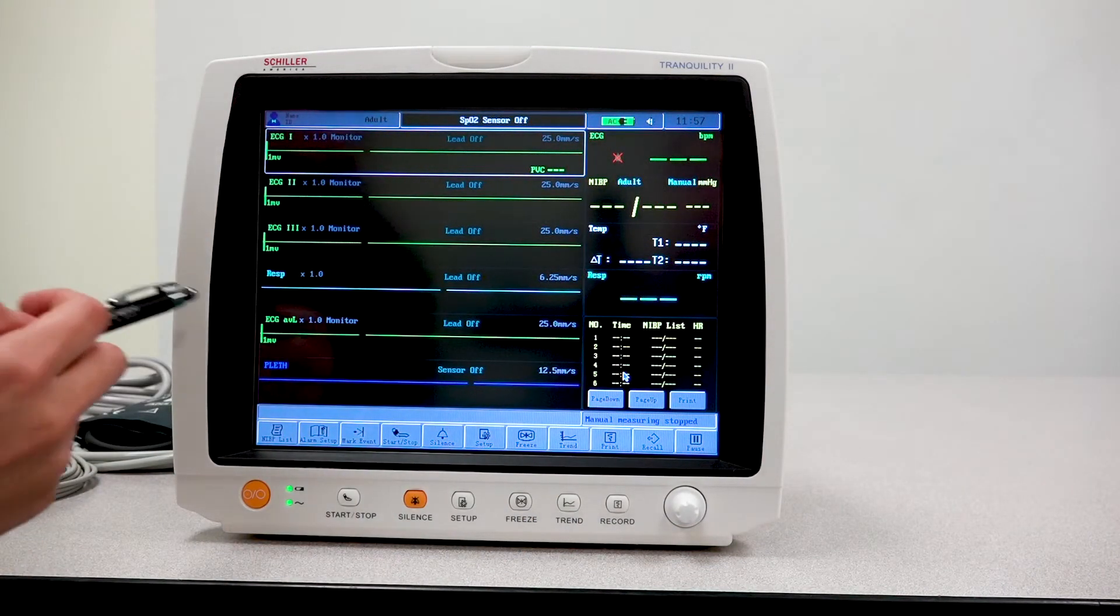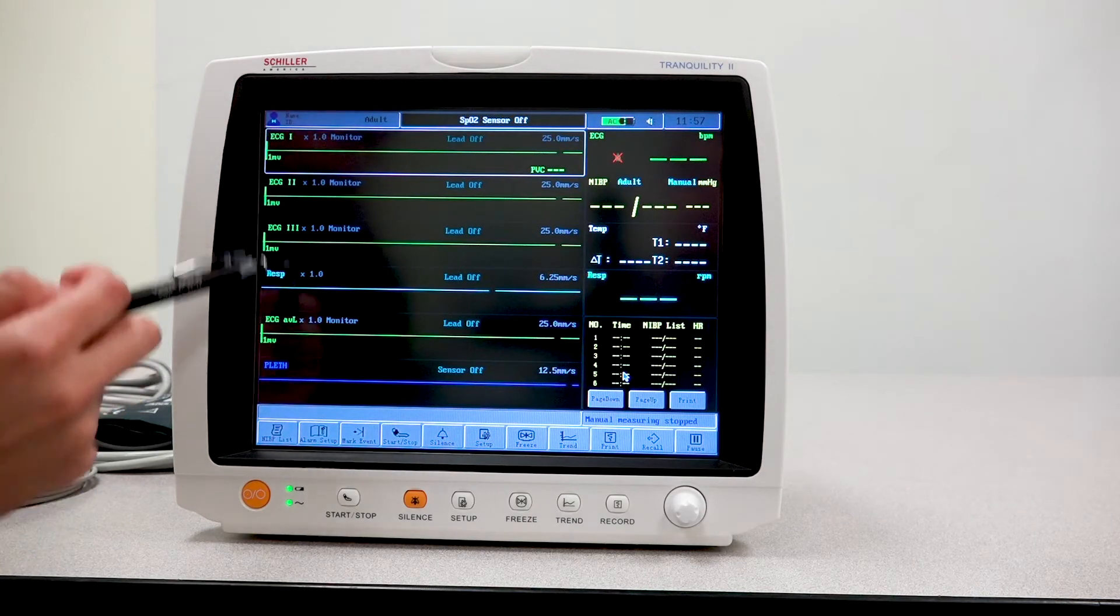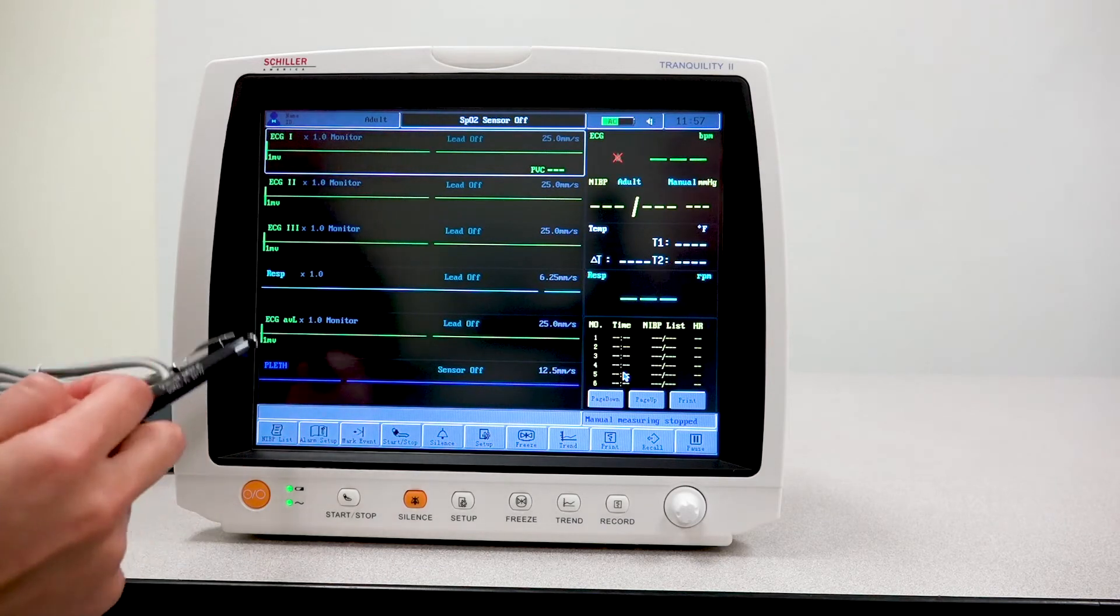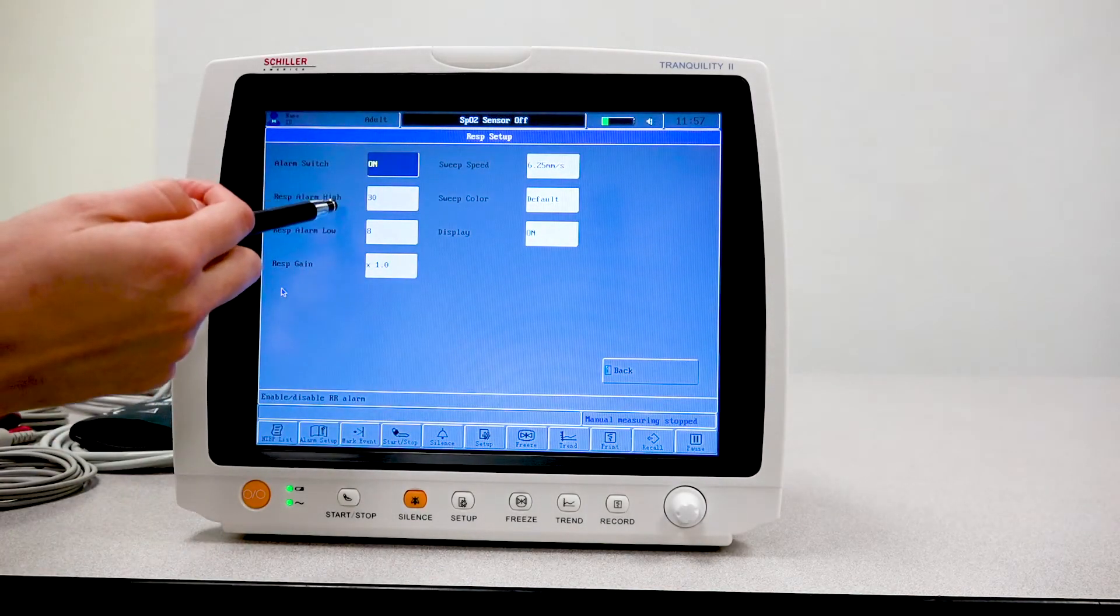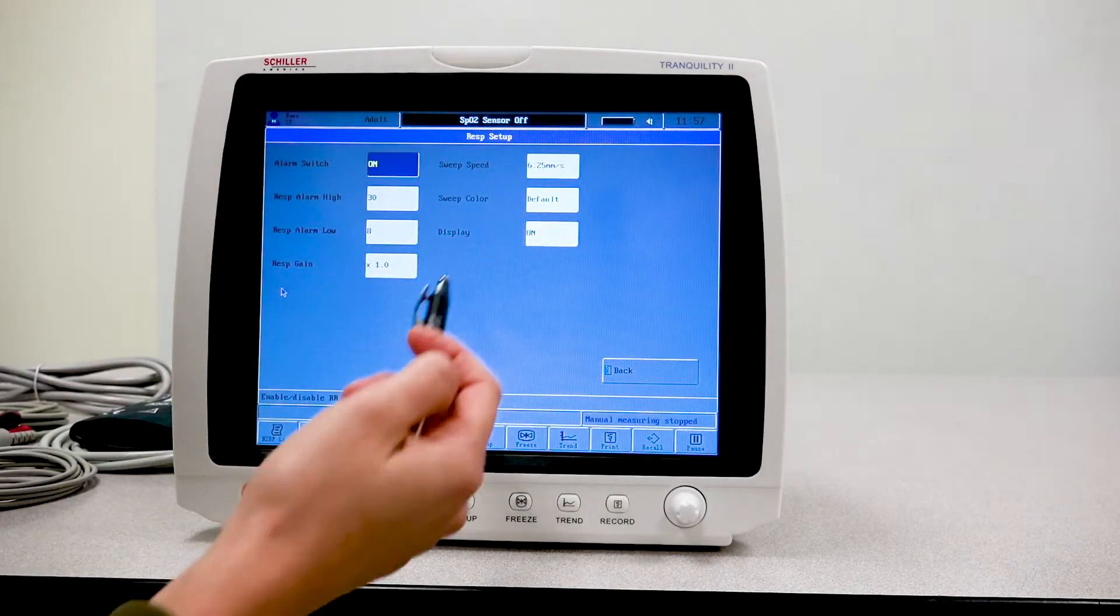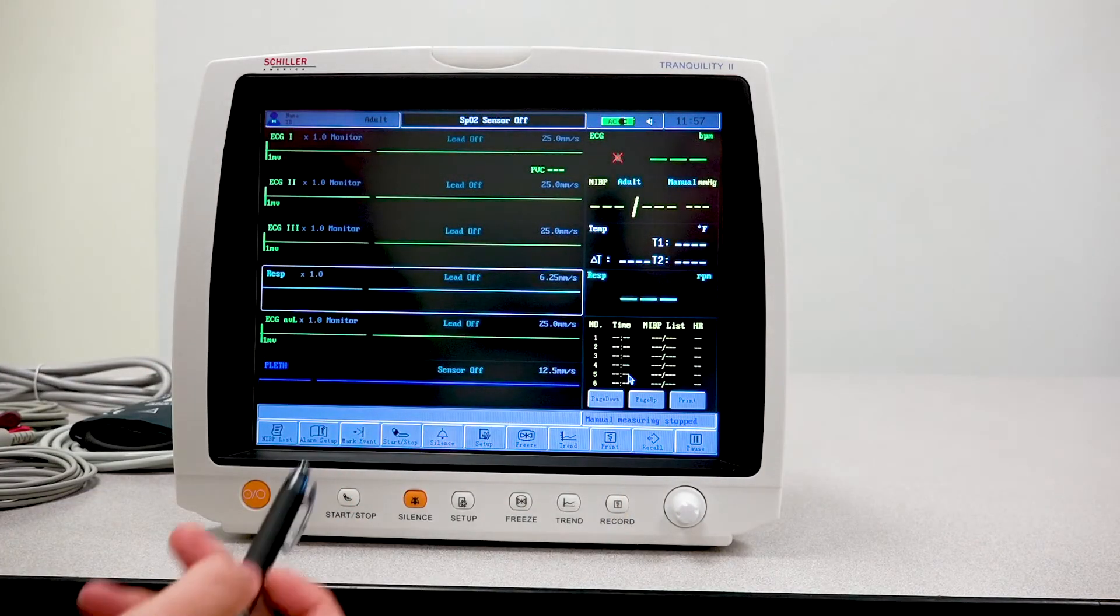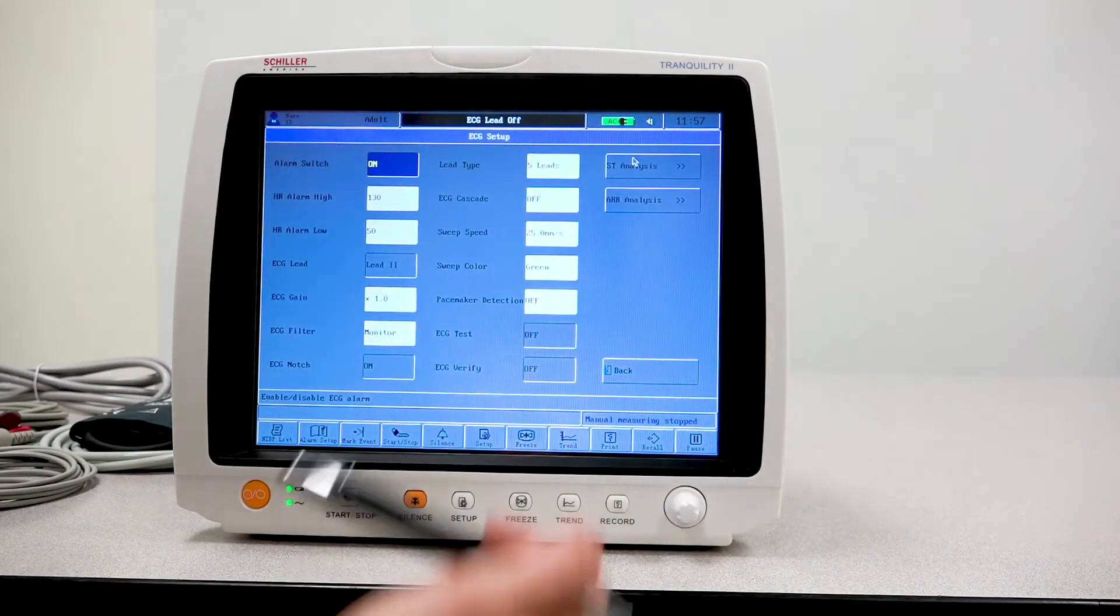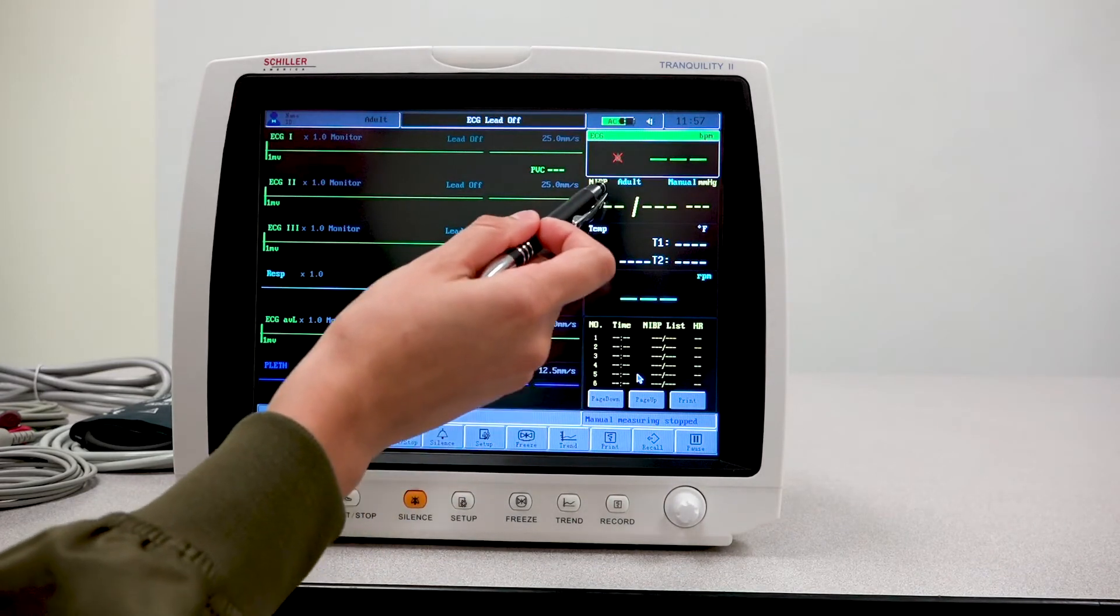Because these following waveforms are linked to the ECG, I'm going to go to the fourth one, which is respiration. Same thing. I'm able to select the high and low alarms, the speed, the color of this particular waveform. And you can do the very same with any other waveforms that you have here on the screen.